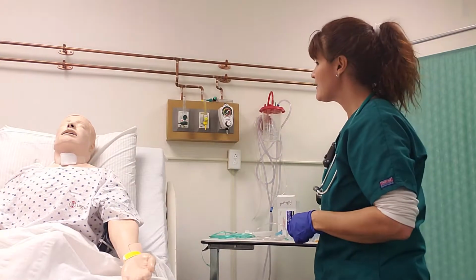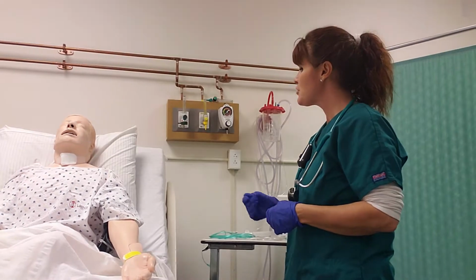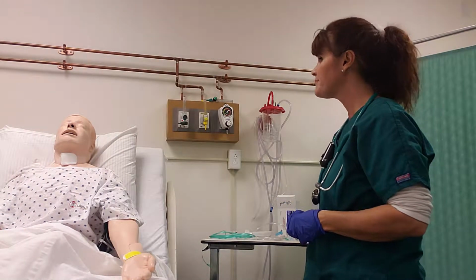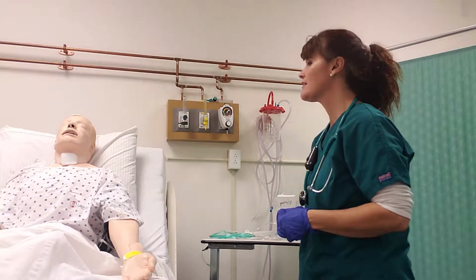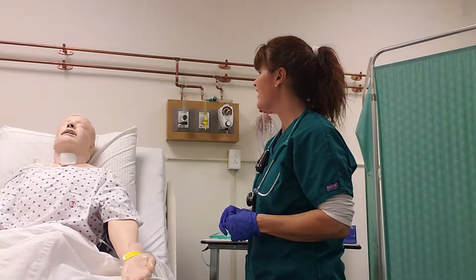Hello, my name is Amanda. I'm a respiratory therapy student. Would you please verify your name and date of birth? Okay, thank you, Mr. Wilson. So I was looking at your charts and I see that your COPD is flaring up.